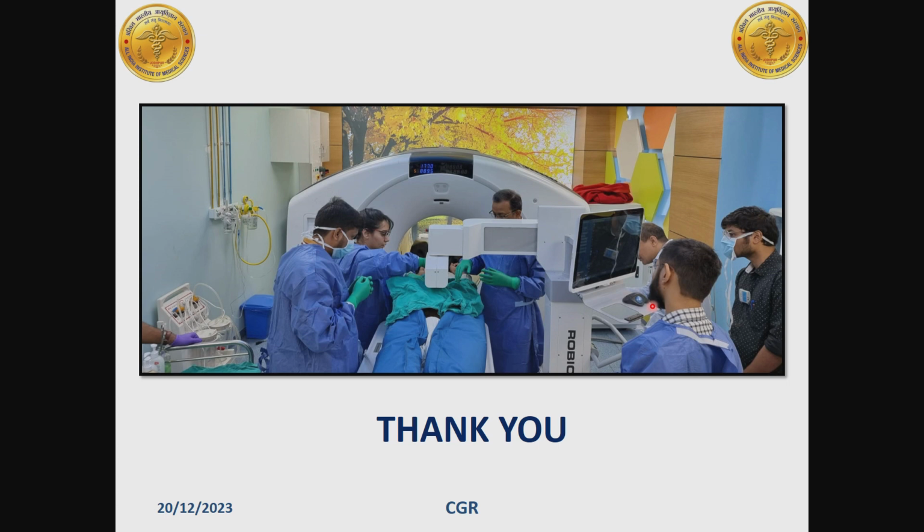Thank you, Deepanksha. That was very nice. And I think it is very encouraging that your department has now embarked on this. It looks very promising that you can take a biopsy sample and immediately do a PET and see whether you've got the sample that you wanted. Because many times when we do it blinded, the sample reports come after some time and we say that it's negative.